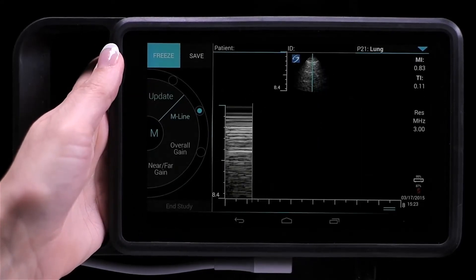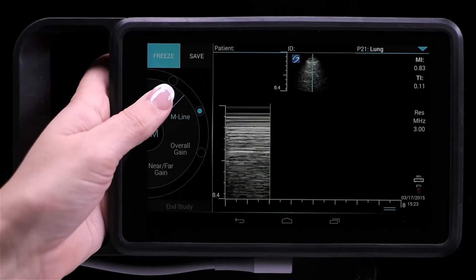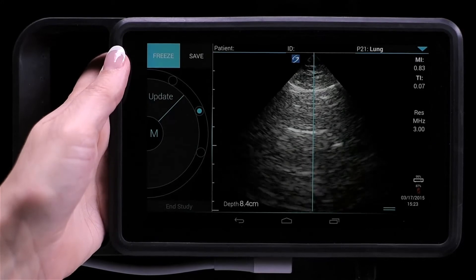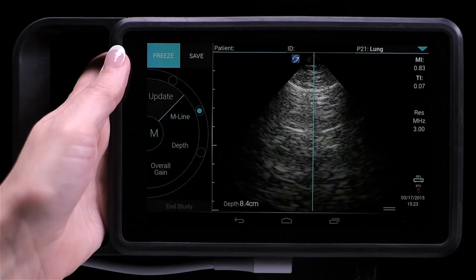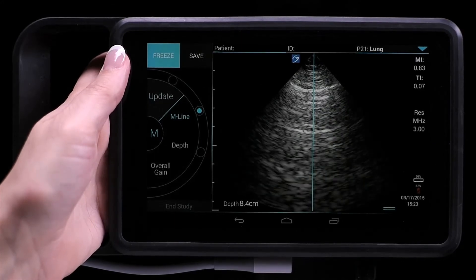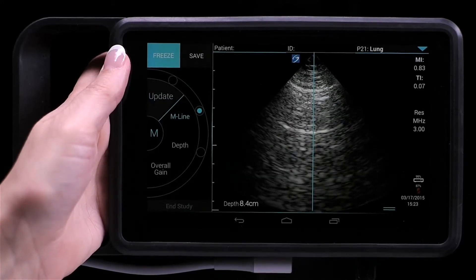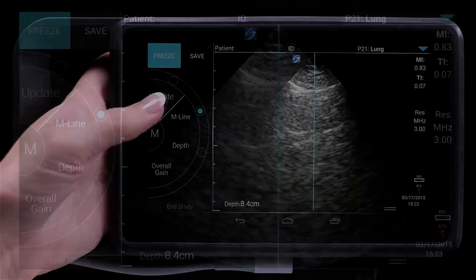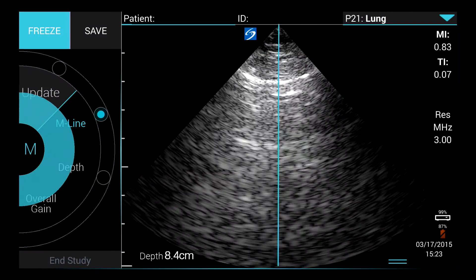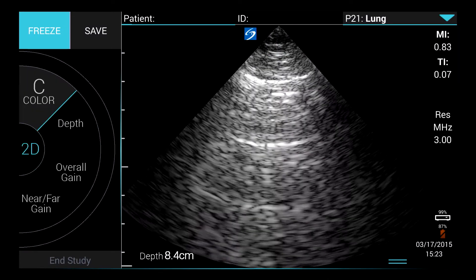Tap Update again to return to live scanning. Press and hold the M button to toggle back to 2D.